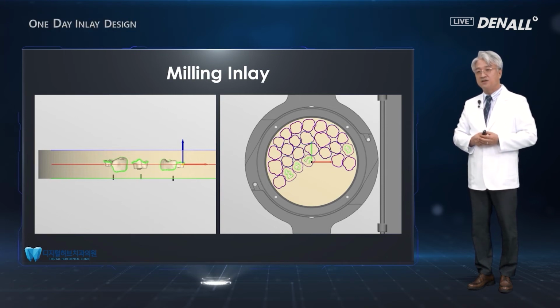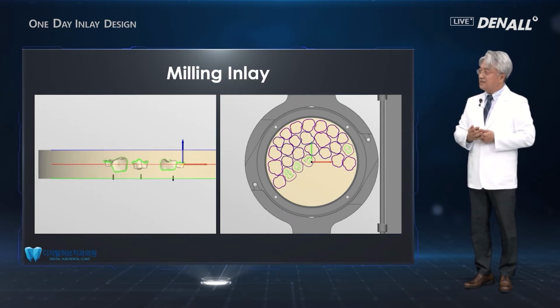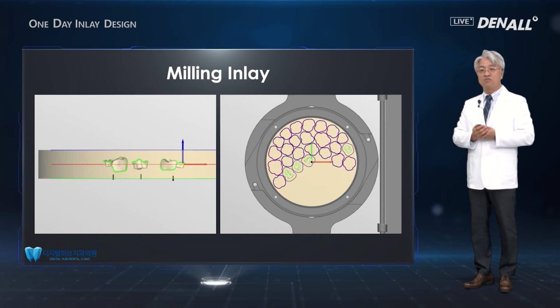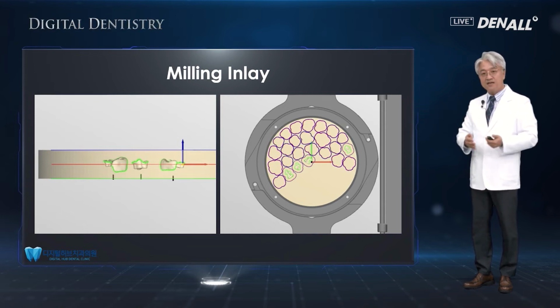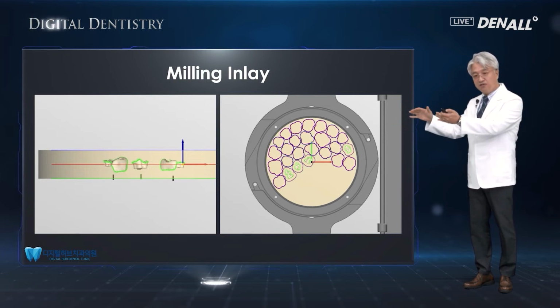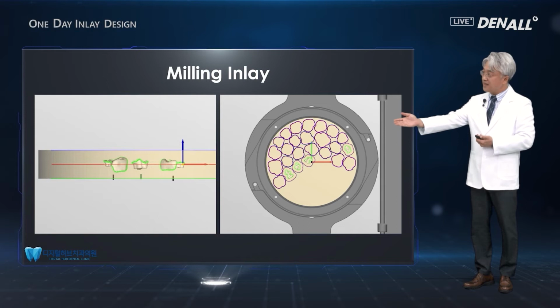In previous lecture, I talked about the CAD-CAM system and told you that CAD and CAM system do exist, but the design software is CAD, and the milling machine does the production. And with the milling or 3D printing, before you do that step, the software used for operating that is the CAM side. So this is CAM.